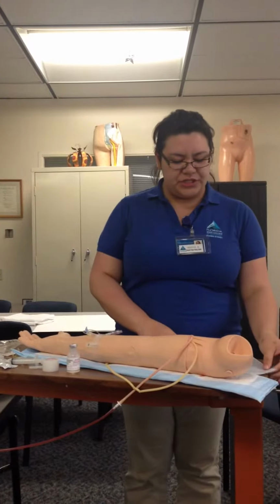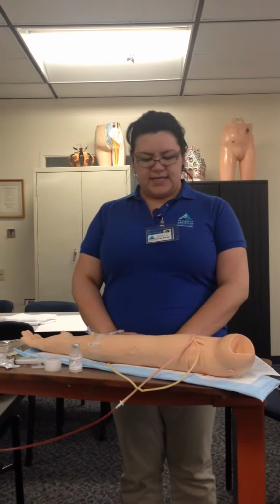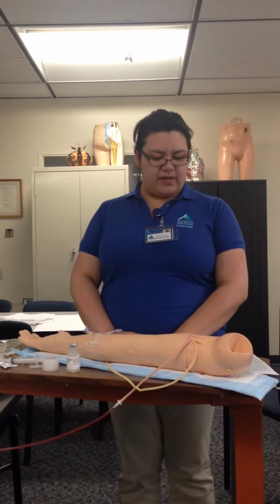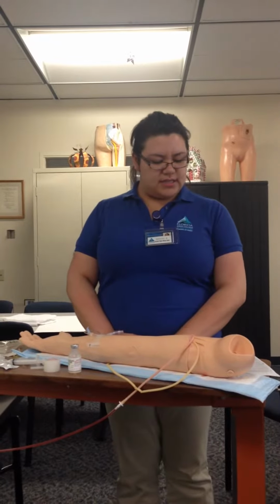Demonstrating administration of an IV med via the Minibag. So first I would check my physician's orders and verify the correct medicine, dose, route, frequency of the med, assess the patient's lab values and history of allergies.